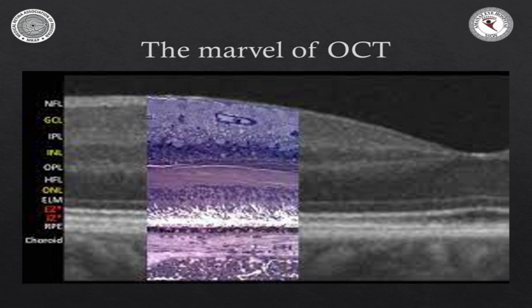So superimpose मैंने की हुई है वो histology वाली diagram है जो हमें फर्स्ट ईयर मेडिकल कॉलेज में सिखाई जाती थी और हमें उसकी डायग्राम बनानी होती थी. And day in and day out we used to see this and we forget that this was a cadaveric sample and we were seeing it under a microscope. And now our patient comes and sits in front of us, and within 5 seconds we've got down to the histological layers. We have in vivo view of the retinal layers.